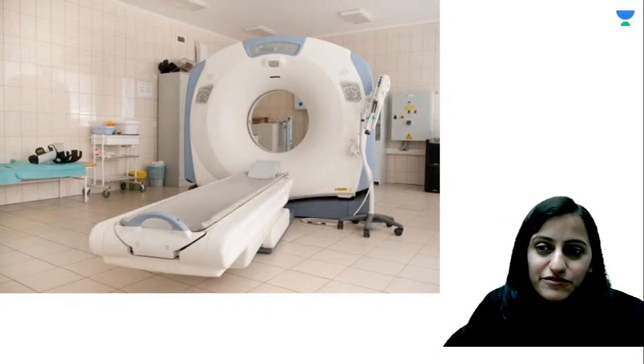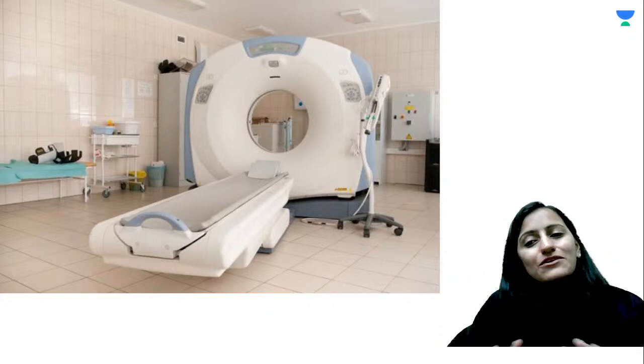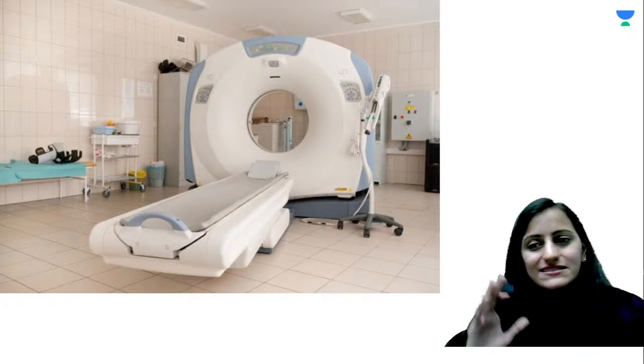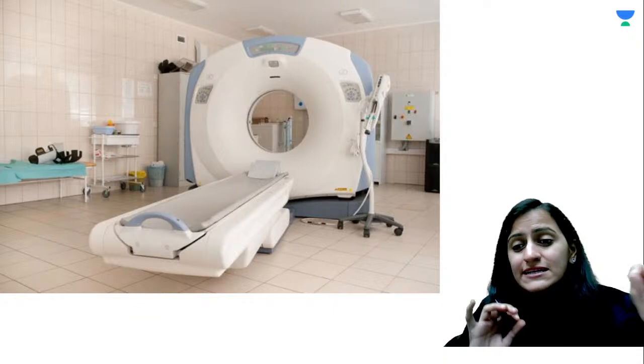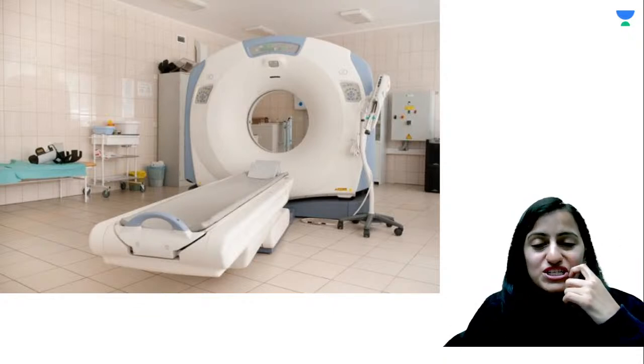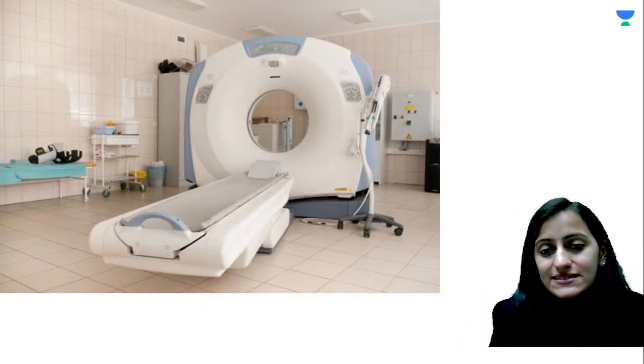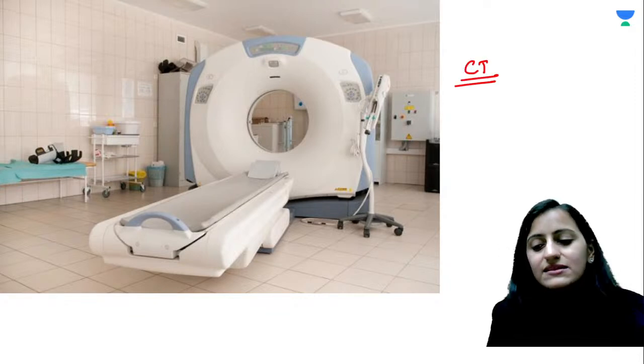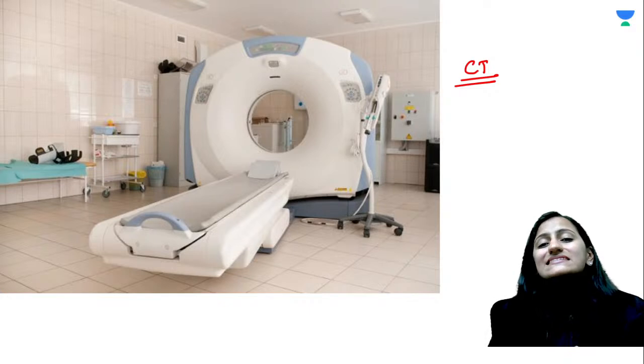Right. So first of all, remember that CT scan and MRI cannot be done with the same machine because the principle is different. One uses X-rays, one does not utilize X-rays. So it's definitely going to be different machines. And this is a CT scan machine. Again, this question has been asked previously in the exam. This is a CT scan. Why is this not a MRI?